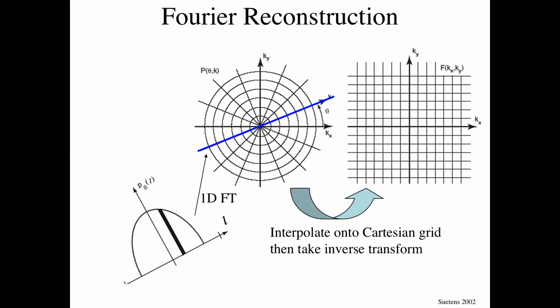The sinogram is the stack of data as a function of theta, but it doesn't really have any physical relationship to what's there. It's just a way to stick your data in the computer. Here, if I put all of these projections radially in one plot and take their Fourier transforms, I get a Fourier transform of the object sampled along these radii.